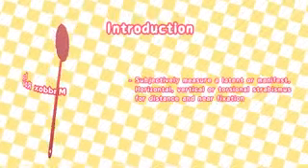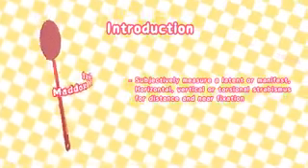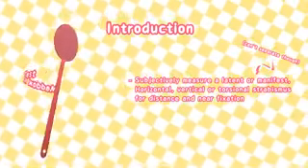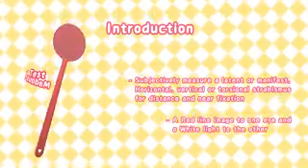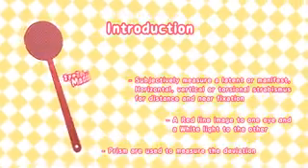I'm an orthoptist, and today I'll be conducting the Maddox Rod test. The Maddox Rod test can be used to subjectively measure a latent or manifest horizontal, vertical, or torsional strabismus for distance and near fixation. The test is based on the principle of diplopic projection. Dissociation of the deviation is brought about by presenting a red line image to one eye and a white light to the other, while prisms are used to superimpose these and effectively measure the angle of deviation.